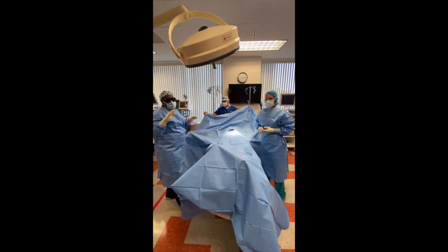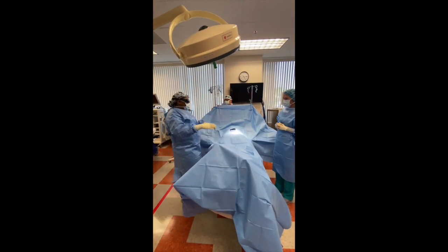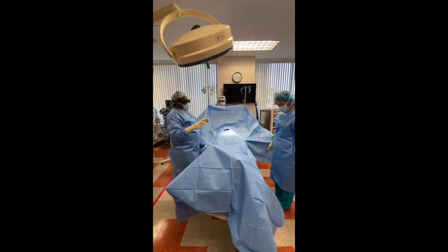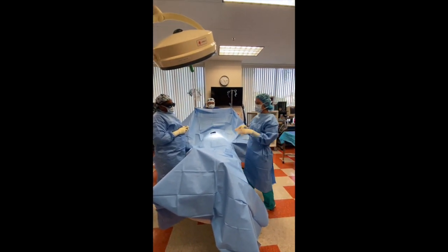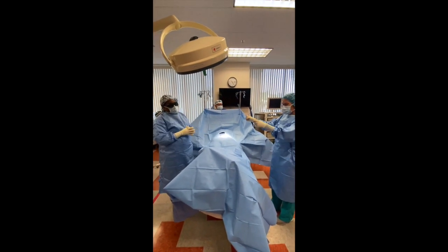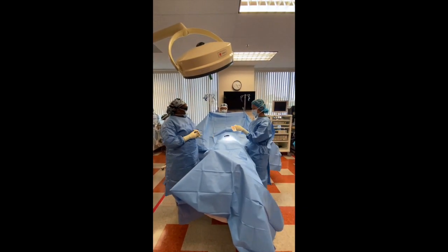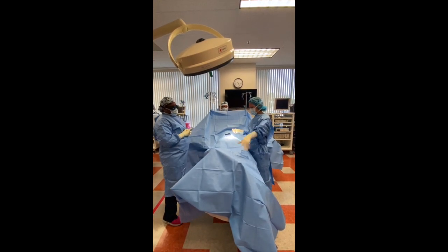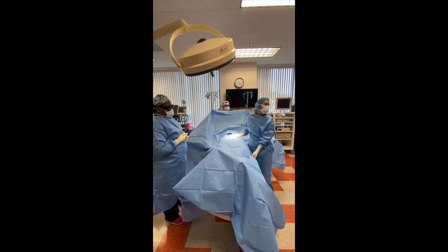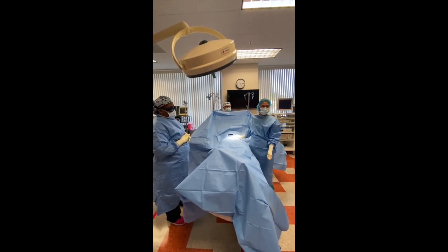What did you guys notice about our hand movements? When we put our drapes, we placed them — we kept it moving. When you guys are draping, a lot of you will get into the habit of dropping a three-quarter sheet and adjusting it. It's just a drop, a release — a cuff hand release. When you grab the drape, you stay on top. What gets students is they want to come down here to find the edge of the drape.